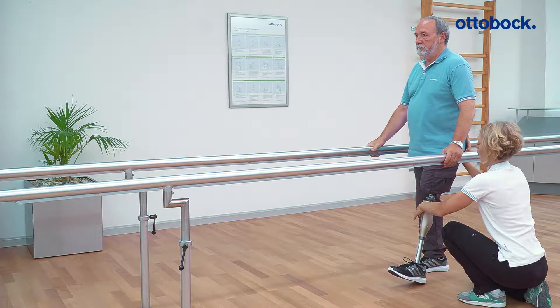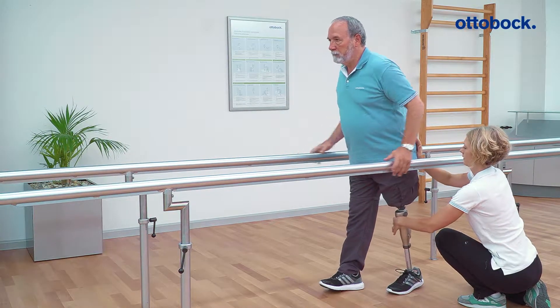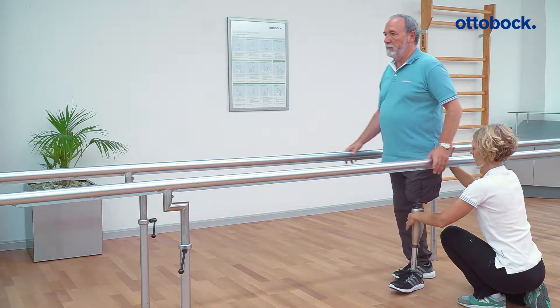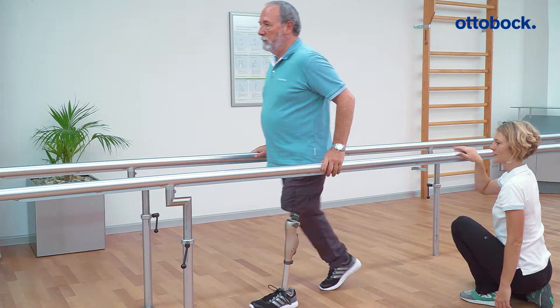An initial assessment of the appropriate activity mode is possible based on the user's medical history and safety needs. The first steps of the user should be evaluated in a safe environment, such as between parallel bars.